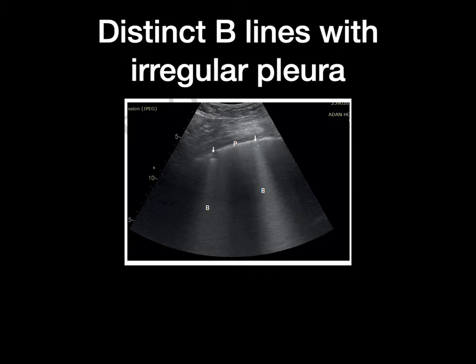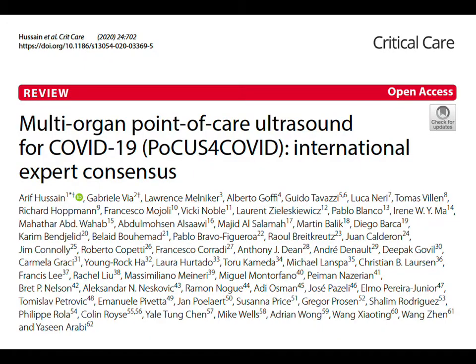Together with everything else, you put it all together in your mind and pull up that mental image of the patient. For that it's very useful, but on its own, I don't think it's enough to make decisions just on what you find in lung ultrasound.